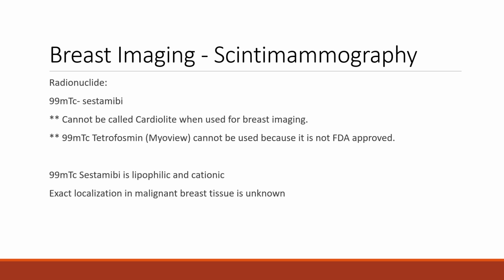Now, for breast imaging or scintimammography, this is not done very often. We also have PET breast imaging. Those use a special scanner too, and they're not widely used. But with the sestamibi, it cannot be called Cardiolite because we're not using it for the heart. We're not lighting the cardio. We're looking at the breasts, so it's called Miraluma now.